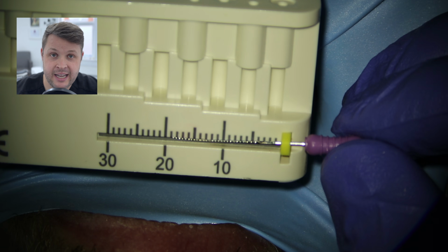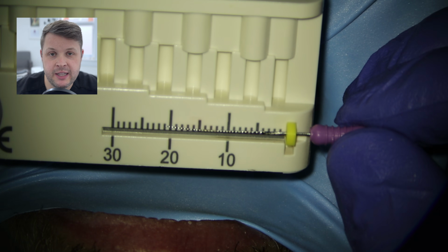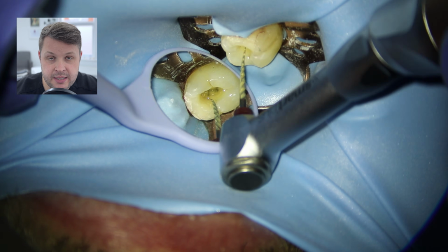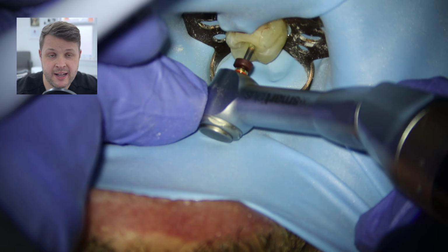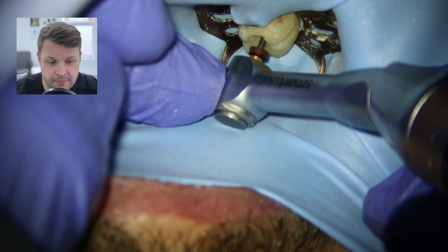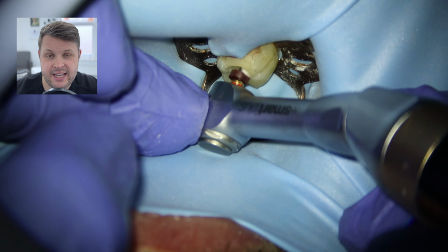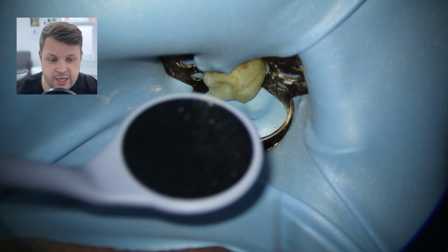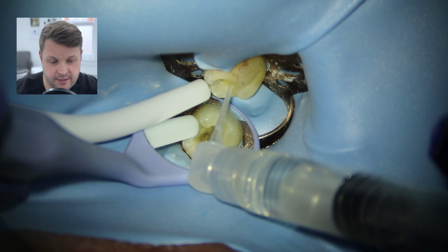We're going to use higher diameter files, but unlike before, I'm going to use this orifice opener because I feel like the mesiobuccal orifice is quite narrow. You know, I could use a size 25 variable taper high flex file just to open this up, but what I'm concerned about is going a little bit too far with this and ledging the tooth. So in this case, I'm just going to use the orifice opener because it's very, very short, so there's no chance of this really thick diameter file cutting a ledge or anything like that.